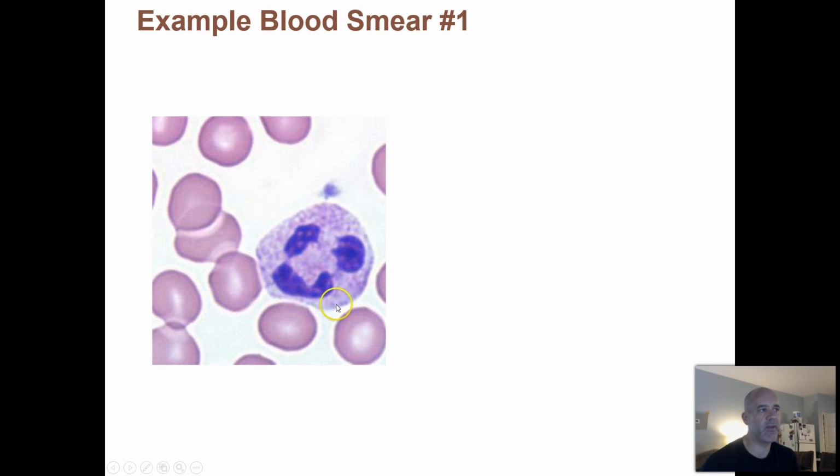All right, and finally, what about this big guy here? This is the more challenging one. This is a white blood cell. The first thing you want to do is ask yourself whether or not you see spotty granules in the cytoplasm. I would say yes, that looks pretty splotchy. Are they pinkish red, or are they bluish purple? Sometimes that can be tricky, but to me this looks more light pink than a dark bluish purple. Light pink is a hint that you're looking at a neutrophil.